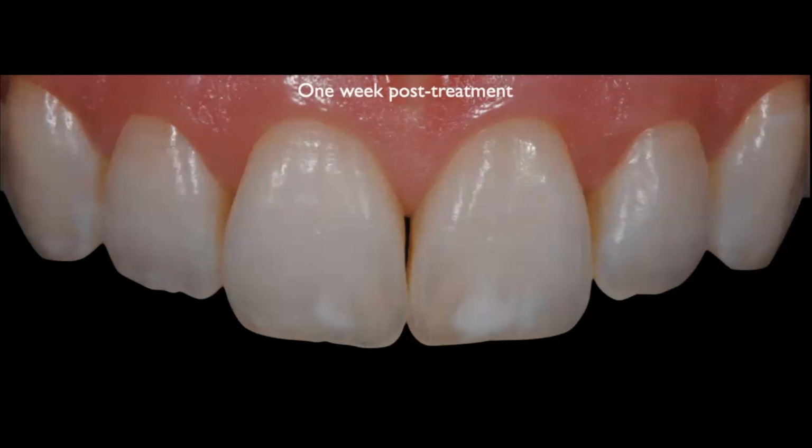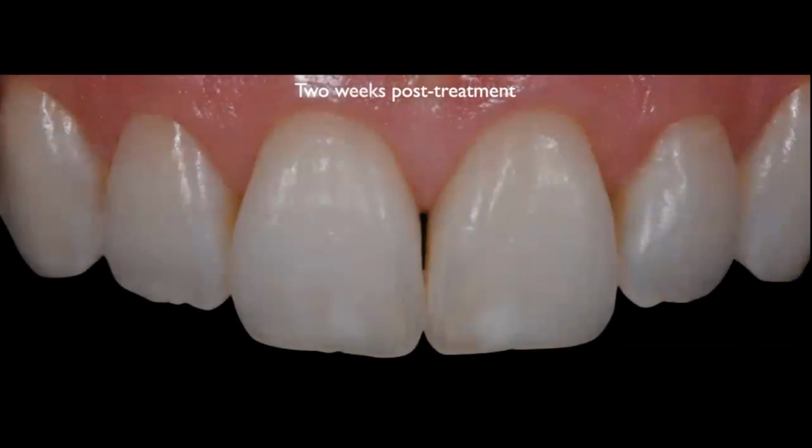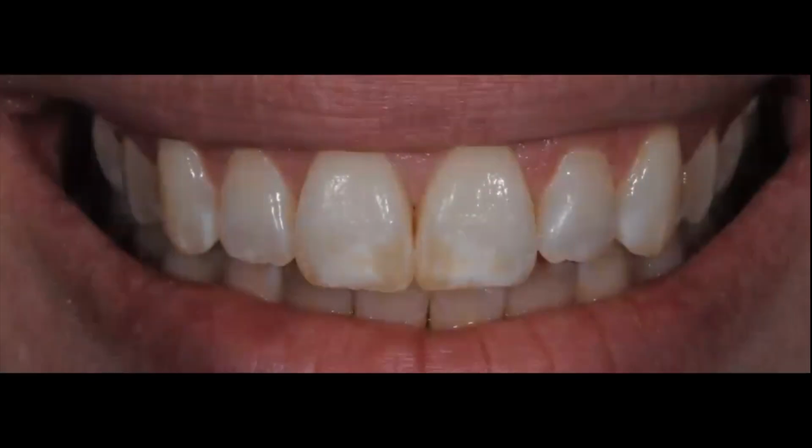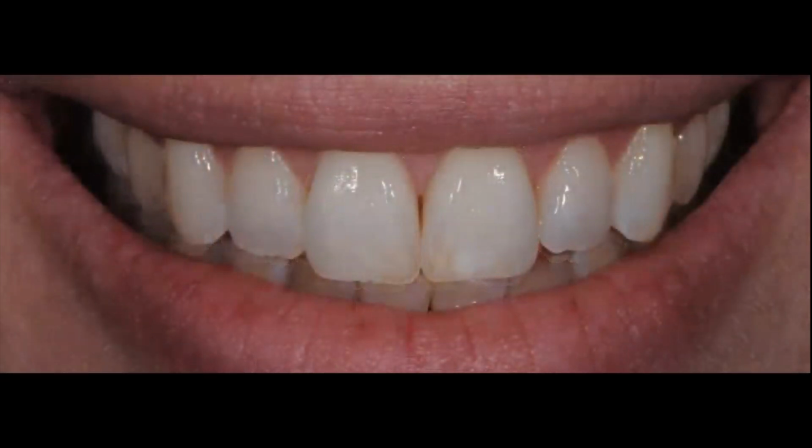We then went ahead and did bleaching for her. With bleaching, we were able to reduce the white spots a little bit more. This is 2 weeks post-treatment, and again, we're just waiting and following up the case. You can see that there's still a little bit of the white spots there, but if you compare that to where we started, you can see that there's a big difference. And again, a combination of microabrasion and bleaching, 10% carbamide peroxide. This is after bleaching. You can see that we've increased the value of teeth, but also look at the white spots. They're a lot smaller than just after the microabrasion. So bleaching does help because it increases the value of teeth, and with this, you're going to mask a little bit of the white spot.